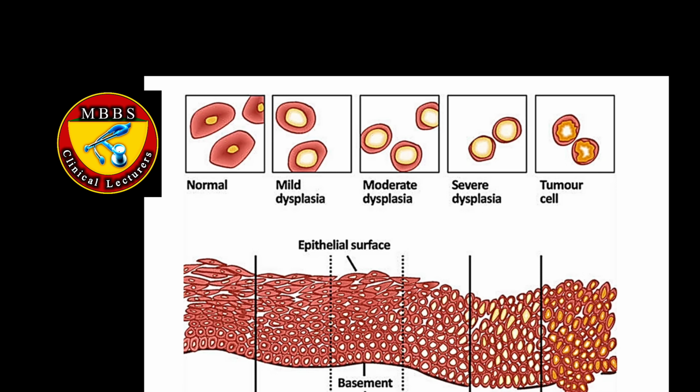This is the dysplasia, mild and moderate. Moderate involves, as I just told you, about the middle third of the epithelium. You can also see the cellular morphology. The nuclear cytoplasmic ratio is completely disturbed, and changes in the shape and size of the cells are also visible.